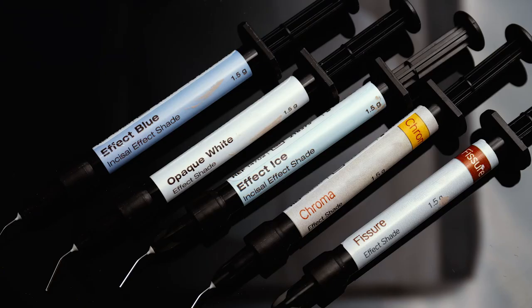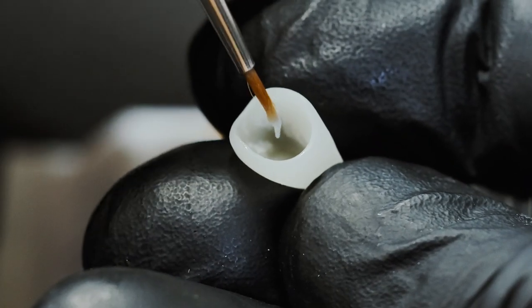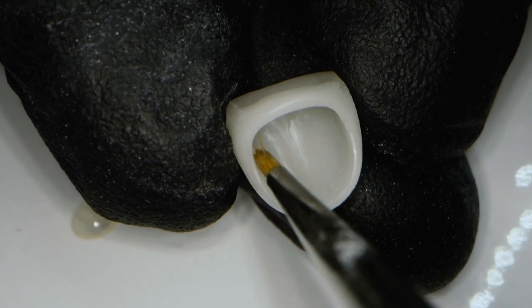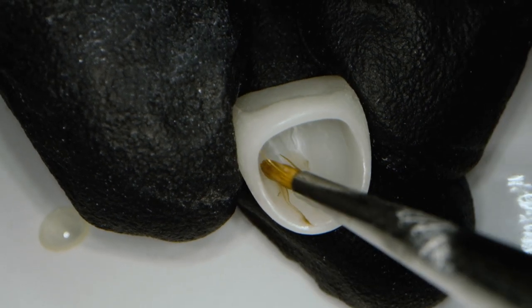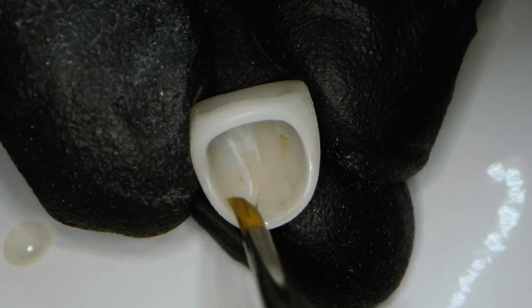For this case I demonstrate the effect colors from Edelweiss. I place the desired colors in the previously ground indentations and simply paint or apply the effects that I want. To simulate a dentine stamp, I apply an appropriate color — for example, a darker shade around the neck of the crown.